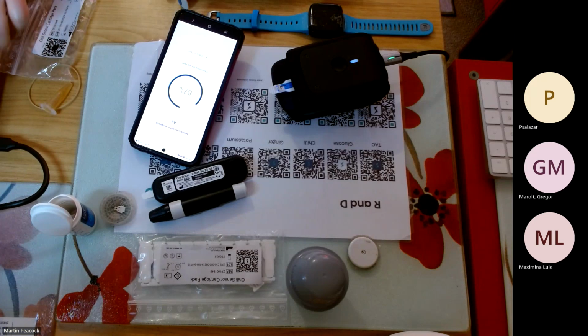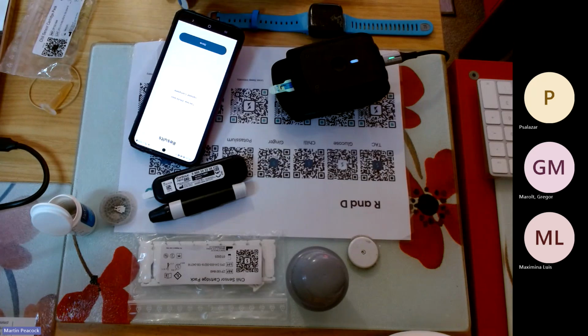Yeah, it's doing cyclic voltammetry, but because the real users don't want to see cyclic voltammetry, I'll just do done there. And what it then does is actually send essentially all the data to the cloud. So I'm just making sure that I've, yeah, here we go. Let's have a quick look. Yeah, beautiful. All right, sweet. So this isn't the world's best cyclic voltammetry, I must admit.